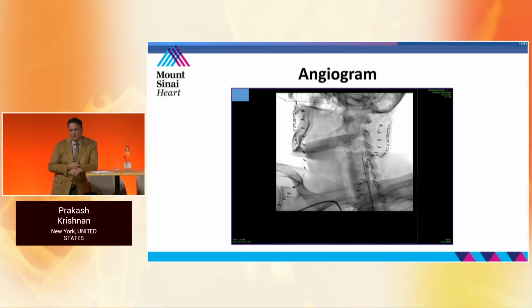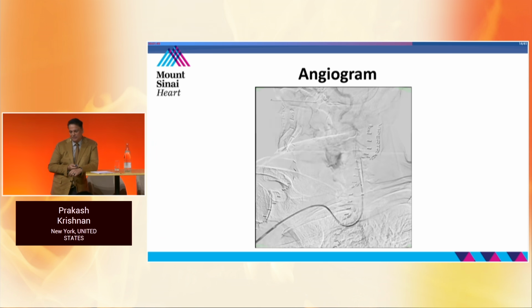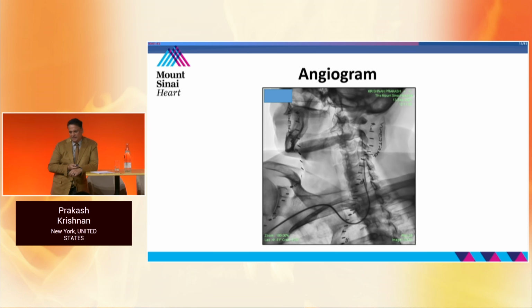And so at this stage, we put the 014 wire distal and then tracked another stent into the common carotid to go ahead and stent the common carotid. And then at this stage, you can see we're retracting the sheath, and we're using, I believe, a 10 millimeter carotid dedicated non-tapered stent. And at this stage, we went ahead and deployed that. And you can see there's flow, but now we still have to stent the ostium.